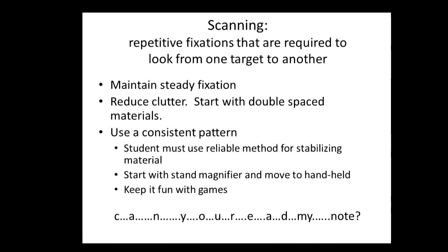Now we want to look at scanning, which is repetitive fixations that are required to move from one target to another. For some students, scanning, they pick it up very easily. They figure it out and little training is needed. But with other students, several lessons, breaking the skill down and building it to more advanced scanning is needed. So making sure that the student can maintain steady fixation.